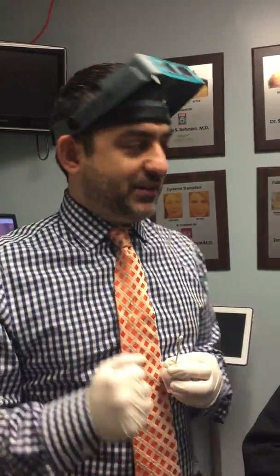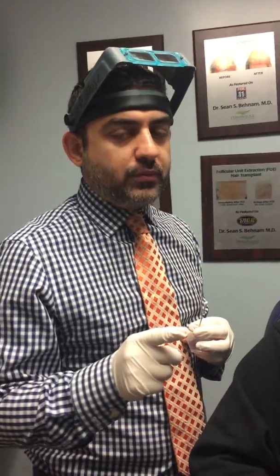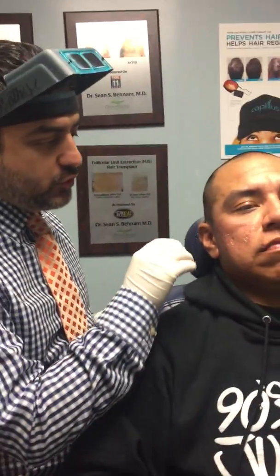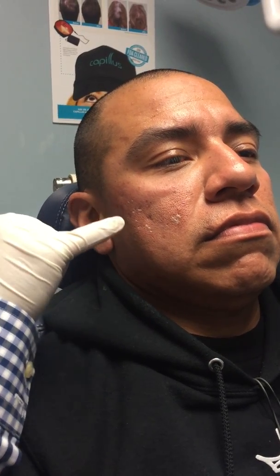We have our lovely gentleman here today, and we're going to demonstrate the TCA cross technique. I've already performed some TCA on his right cheek. If you come a little closer, you can see that the TCA, once we apply it, turns a little bit frosty — that means a little bit white. I applied it specifically into the acne scars.